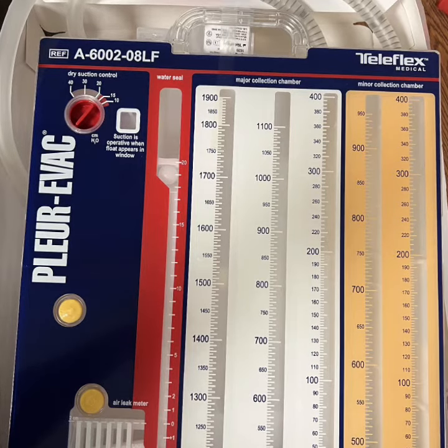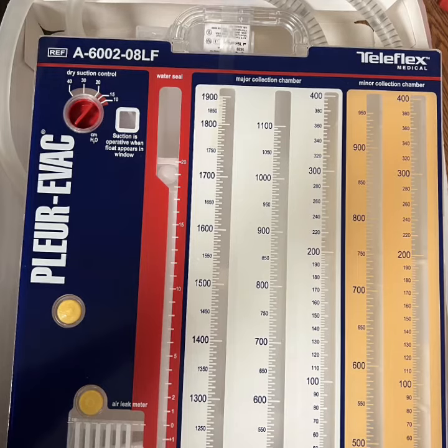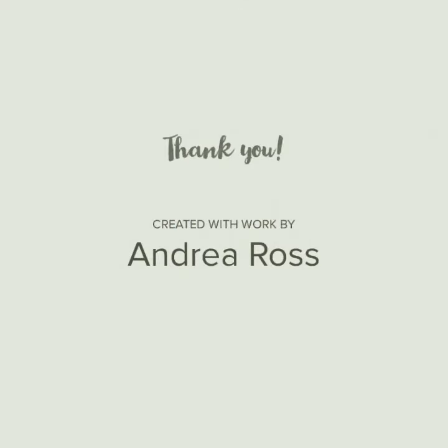Turn up the suction until the orange float appears in the window by the red dial. As always, if you have any questions, reach out to your educator.